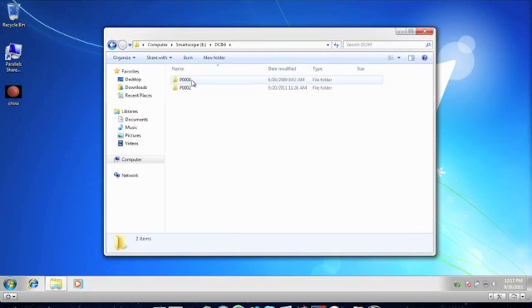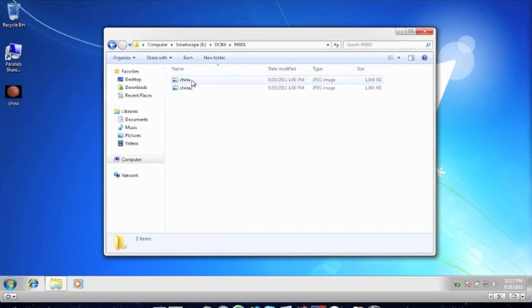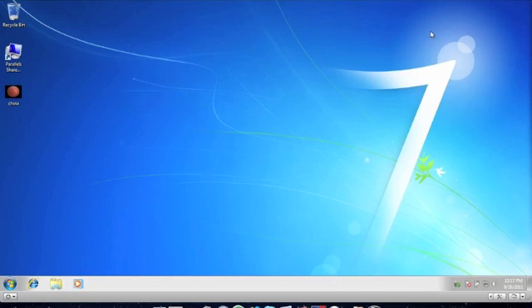Inside there is where the patient folders are. P001 dictates that it is patient number 1. The images are stored as JPEG files.